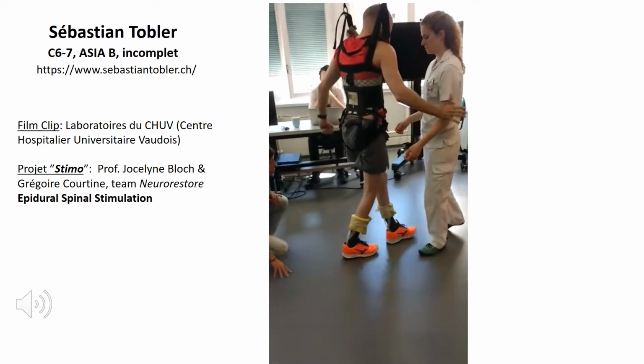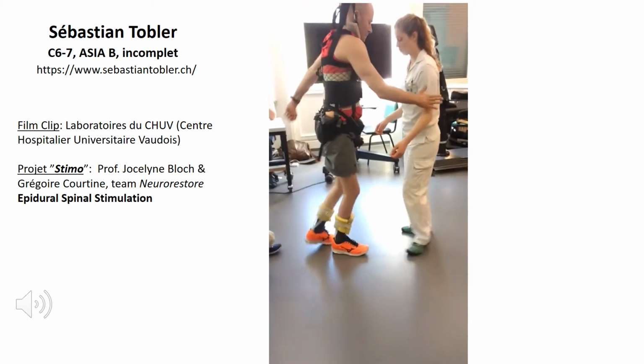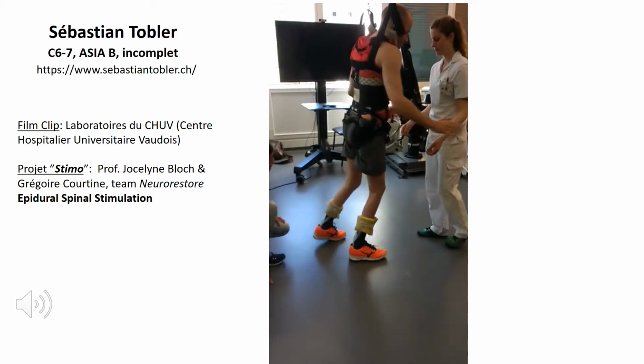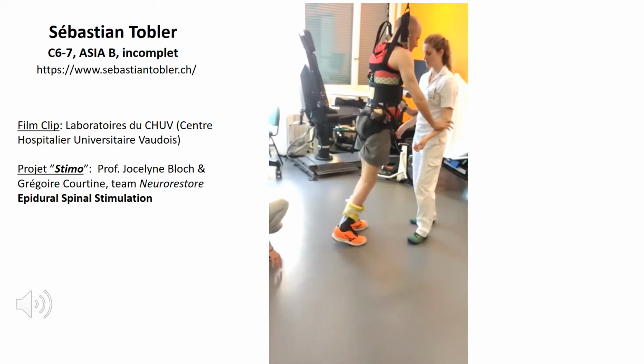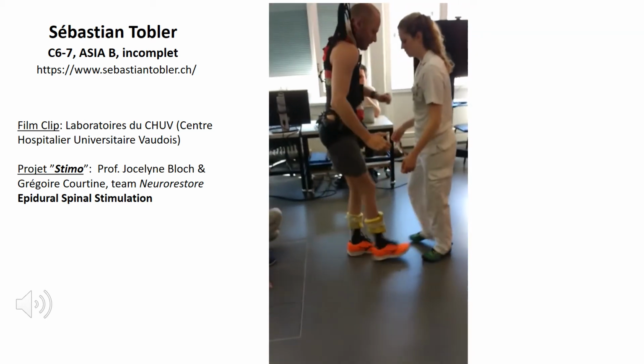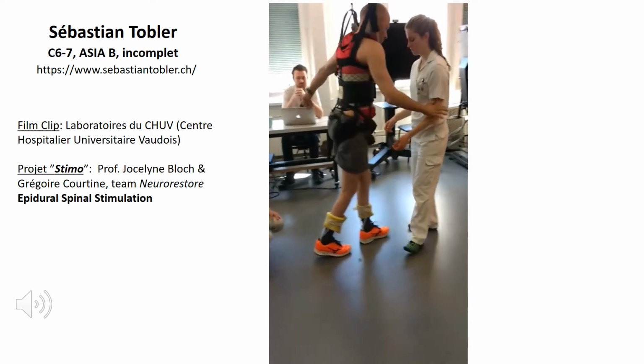What I'd like for you to imagine now is that if Sebastian had an exoskeleton that would help him guide his movements, that we combine the stimulation that he has with a light exoskeleton.